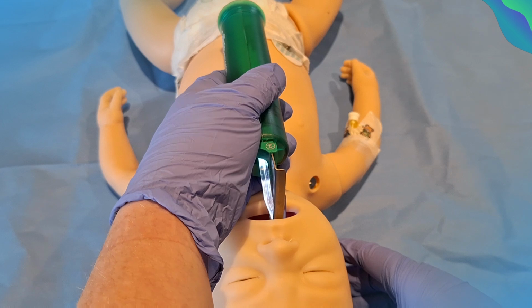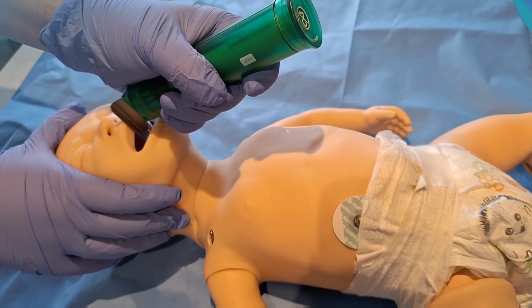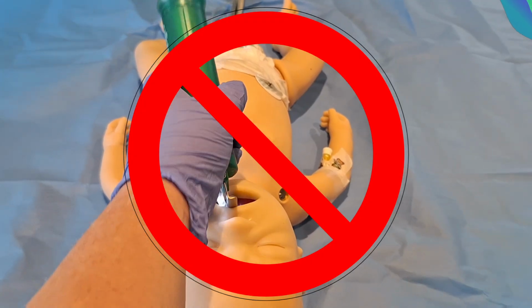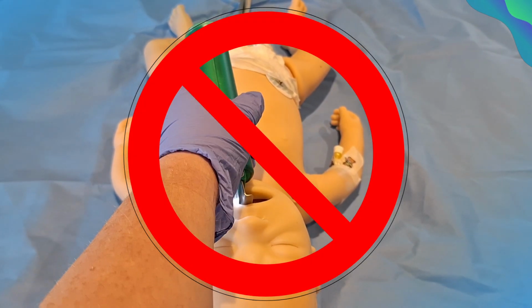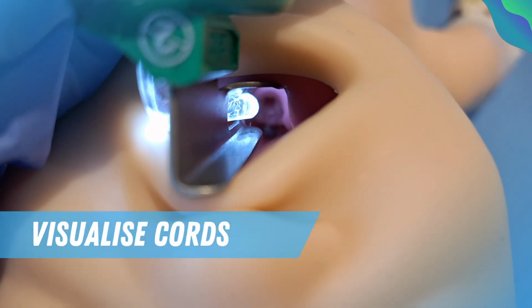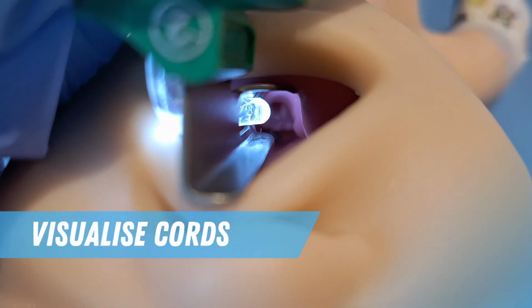Carefully insert the laryngoscope into the mouth, taking care not to damage the lips or palate. The laryngoscope should be adjusted in an upwards and outwards direction. Don't rock it up and down as this can damage the palate. Place the tip of the laryngoscope blade anterior to the epiglottis into the vallecula and lift it upwards and outwards. The cords should then come into view.